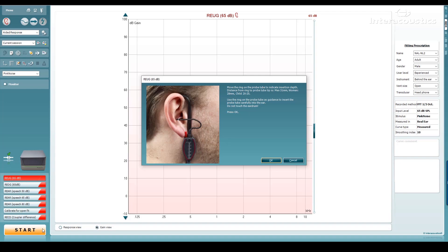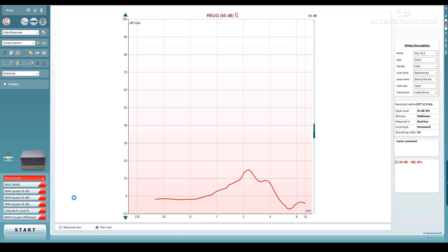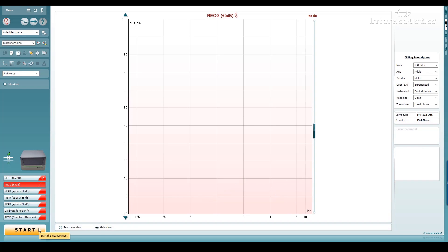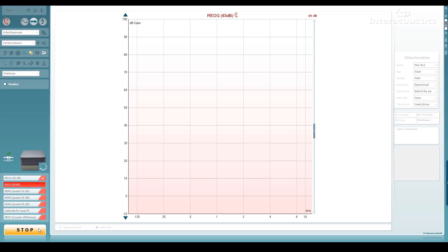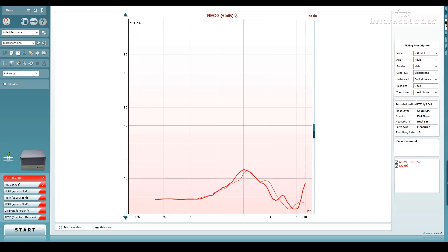Your REUG measurement allows you to measure the effects of the unamplified ear. This measurement is not necessary for real ear aided response measurements, but it is useful for assessing probe tube placement and for assessing whether to run a calibrate for open fit in comparison with the REUG measurement. The REOG, or real ear occluded gain, is a measure of the occluded ear. To do this, insert the hearing aid into the patient's ear and ensure it is muted or off, then run your measurement. This measurement can be compared against the real ear unaided gain measurement. If it looks the same, you will need to perform the calibrate for open fit measurement. If there is a difference, you can move on to your aided measurements.